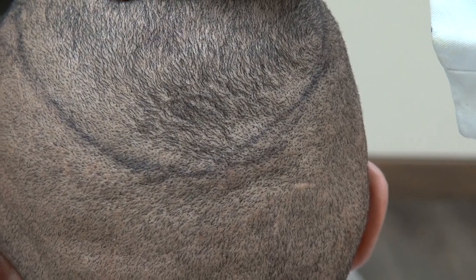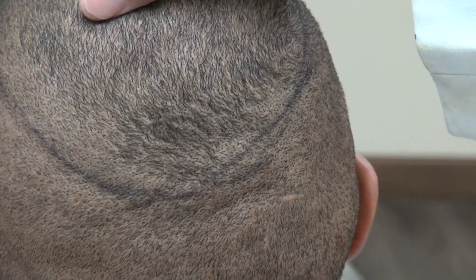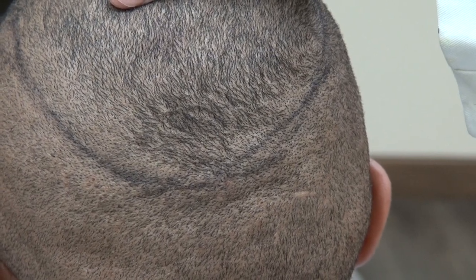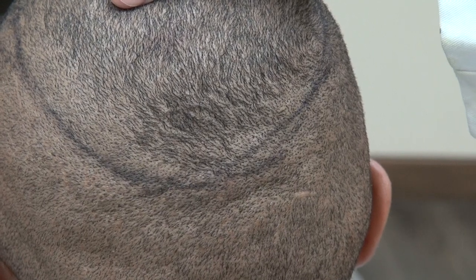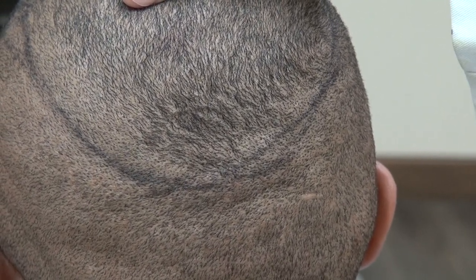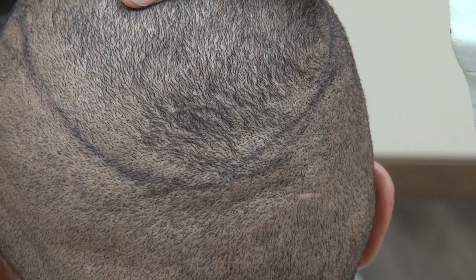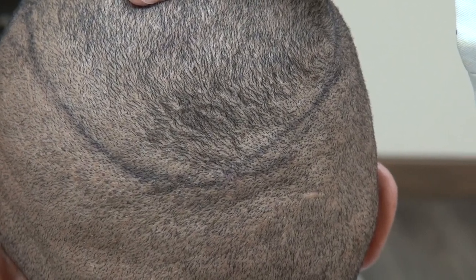I use 0.9 and 1.0 millimeter tips, and they produce scarring identical or very close to 0.7 and 0.8 millimeter tips. The big difference is that 0.9 and 1.0 millimeter FUE tips produce better results — harvesting healthier roots — and thus give you better density.